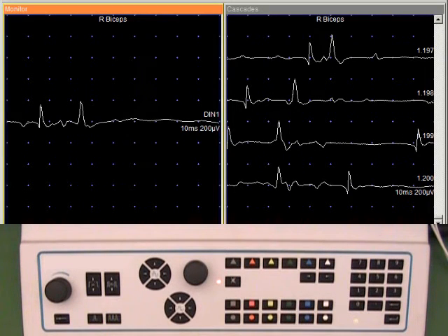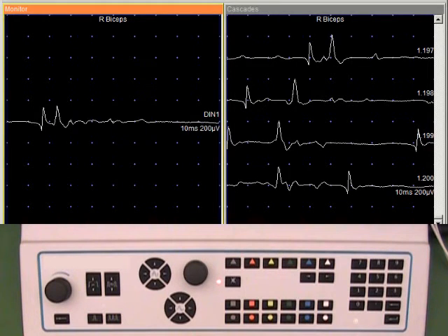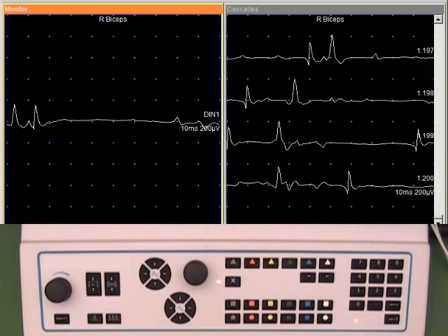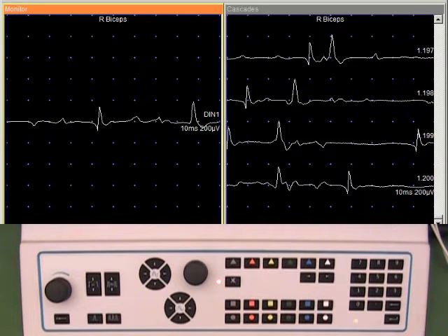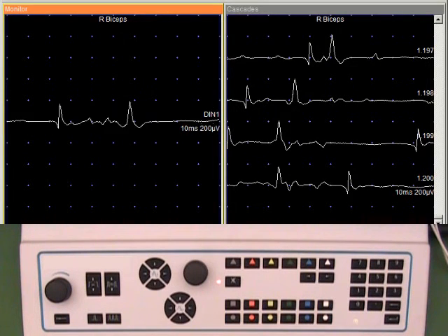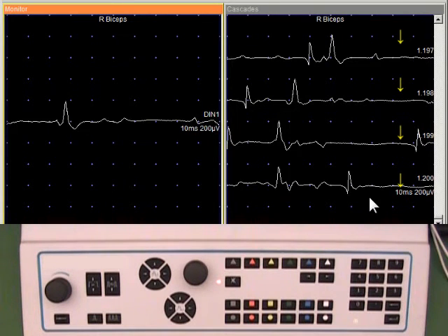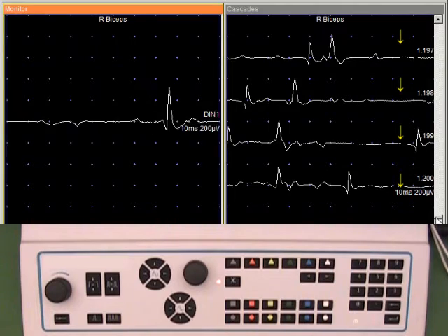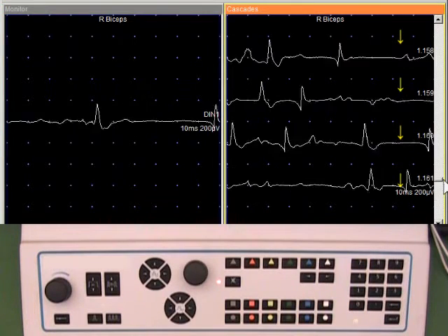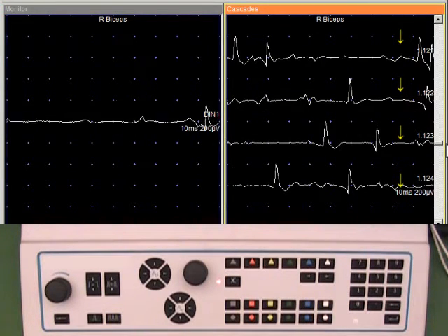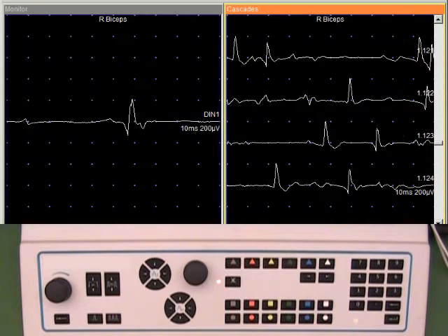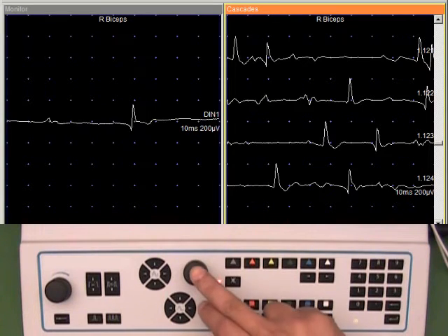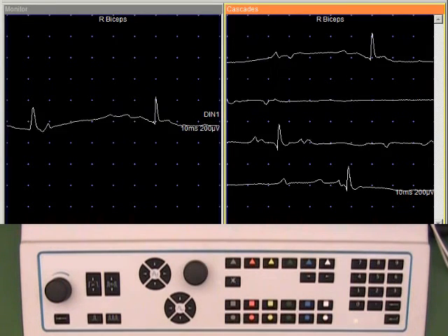Note that it automatically mutes the audio so that you can devote your attention to waveform analysis. The right half of the screen shows the cascades which are individual sweeps that are saved in the system memory. We have 200 such cascades. We can raster through them as necessary. To continue with data acquisition push the select knob.